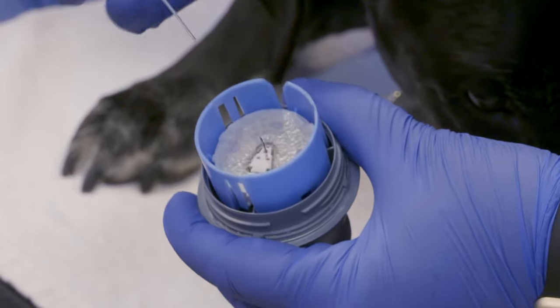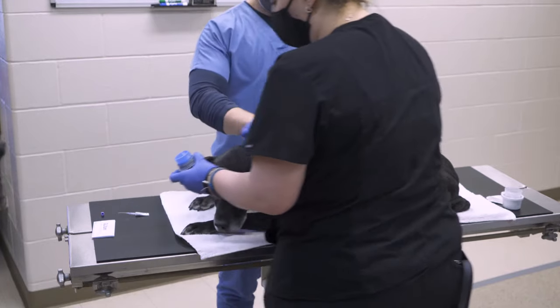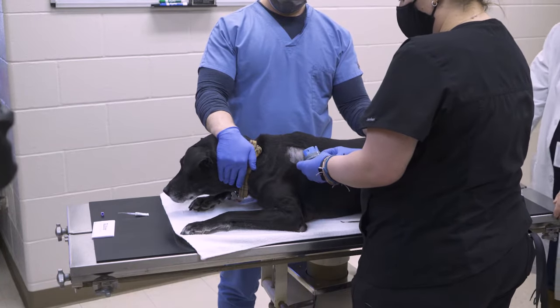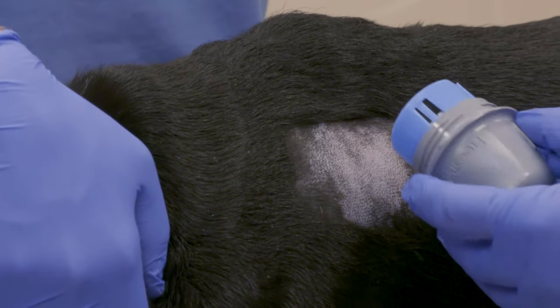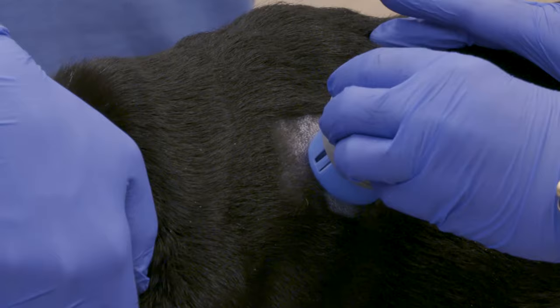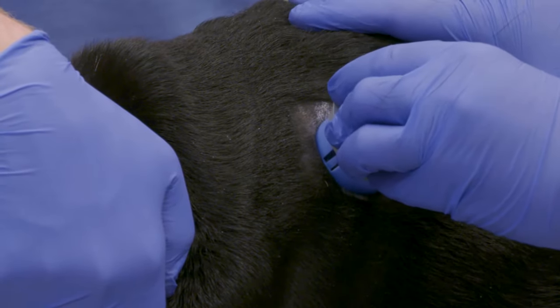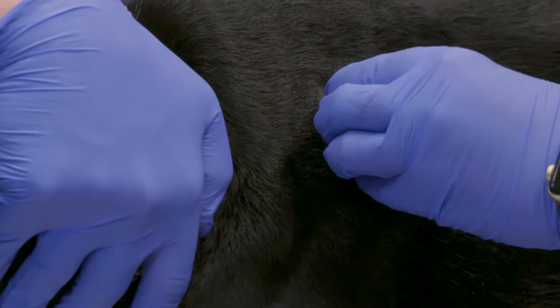Be sure to apply the sensor immediately after applying the tissue glue to prevent the sensor from sticking to the applicator. We will first demonstrate placement in a diabetic dog. Place the loaded applicator on the prepared skin, taking care to place it at 90 degrees to the skin. Push down firmly on the applicator and hold for approximately 30 seconds.